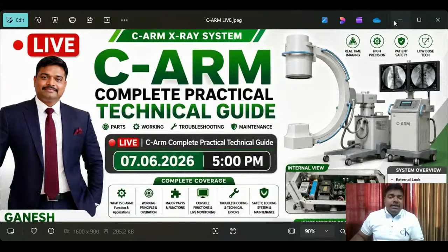Now here I'm going to read our live session. See here, today's date: 7/6/2026, 5 p.m., Sunday. So Sunday is our live session. C arm: complete practical and technical guide, parts and working, troubleshooting and maintenance. See, my intention in this live session is C arm equipment. You can see here, C arm, C shape. Everything I'm going to show you, and in the next PPTs, every piece of information is very useful in your life. Every biomedical engineer should have these skills.